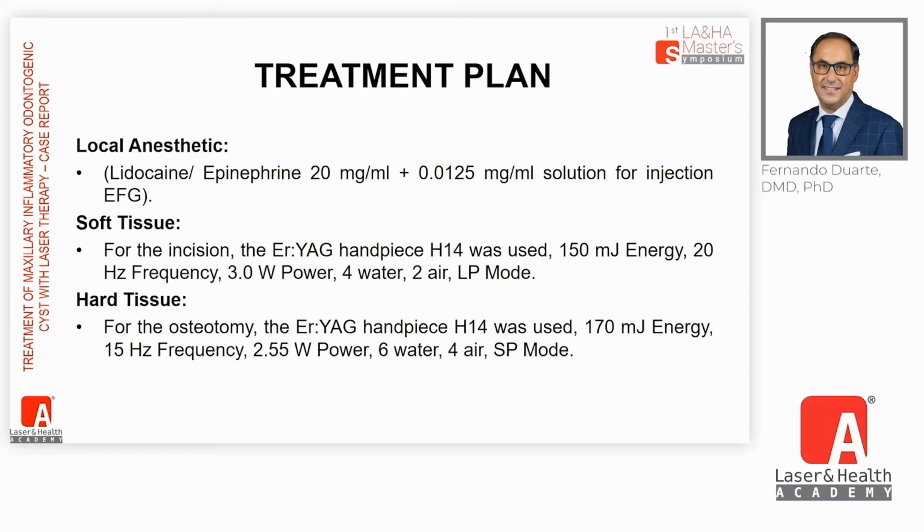For that we use the LightWalker laser with some settings. The first setting was for the soft tissue. We did the incision with the erbium YAG using the handpiece H14 with 150 millijoules, 20 Hz, 3 watts, and a combination of 4 for water, 2 for the air in the LP mode.